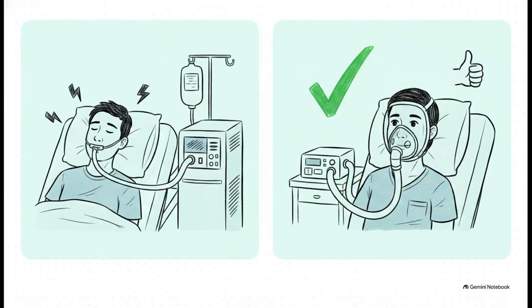It basically comes down to two paradigms. On one hand, you have invasive mechanical ventilation. This means placing an endotracheal or nasotracheal tube directly into the airway. It gives you definitive total control, but it requires heavy sedation and carries a really high risk of complications.